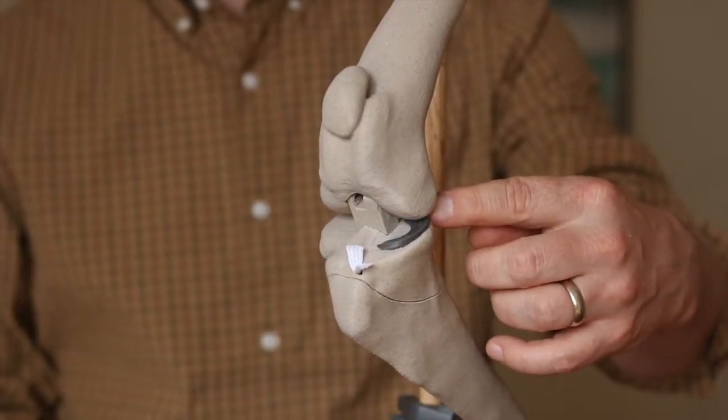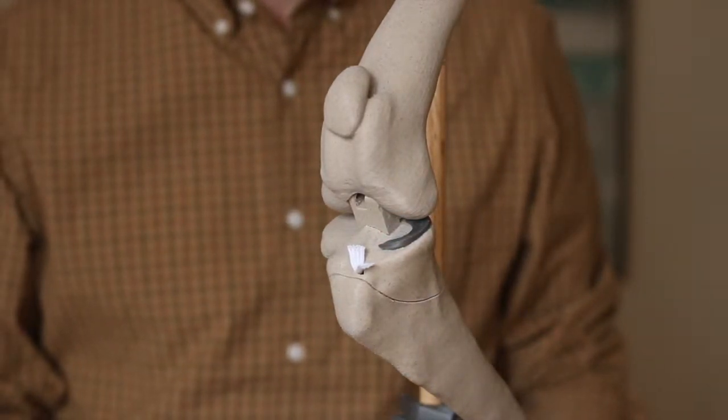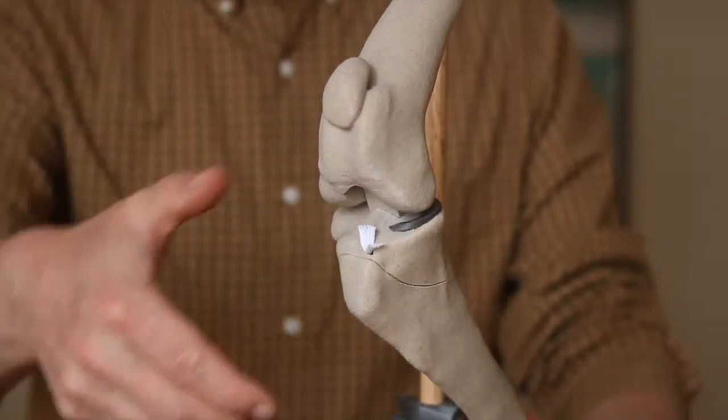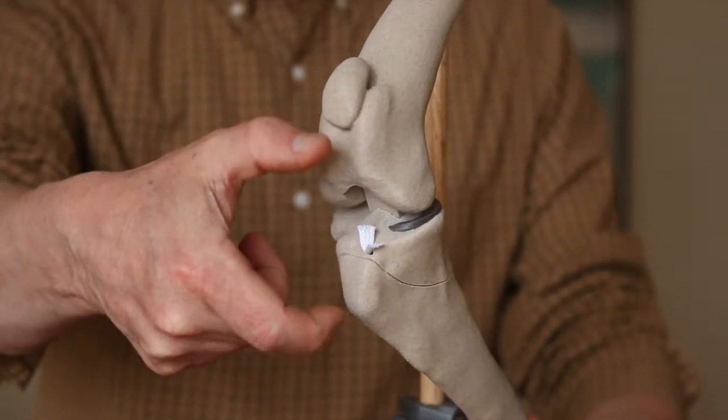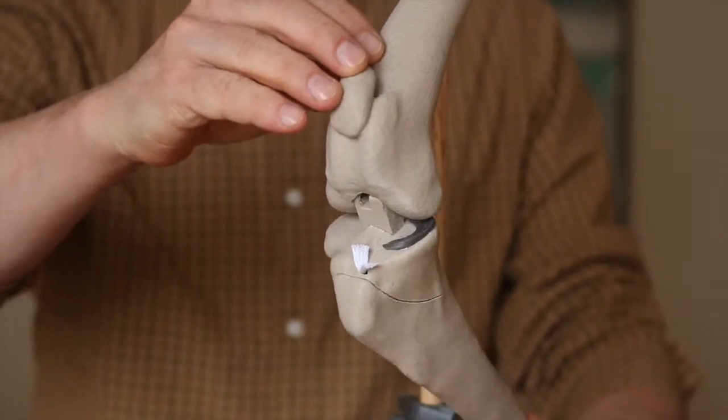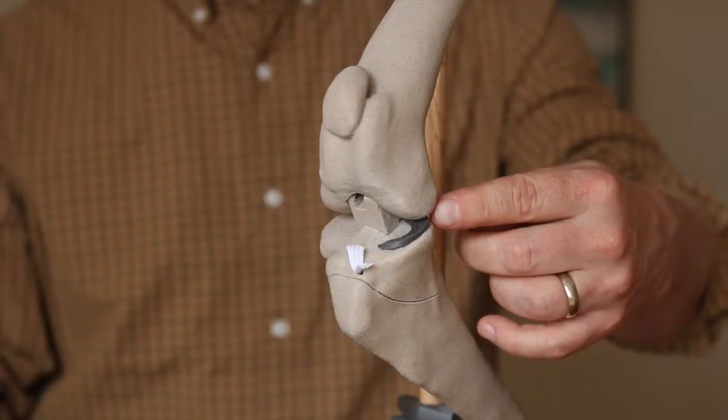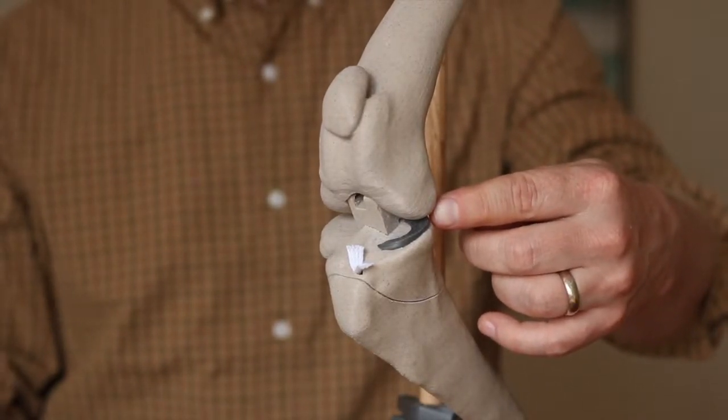The other structure to mention is this gray pad here—that's the medial meniscus, and it's a shock absorber that cushions the impact between the femur and the tibia. When the cranial cruciate ligament is torn and you start to get a lot of this drawer movement, you can see that the back end of the medial meniscus gets crunched between those two bones and can become torn.